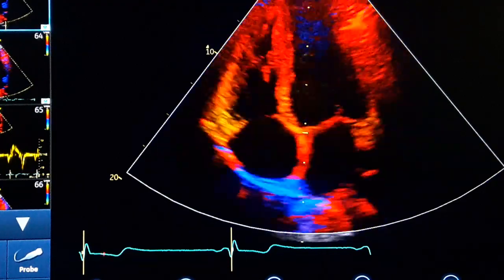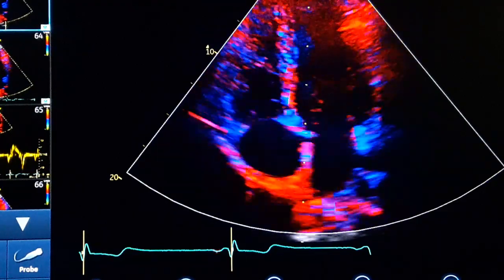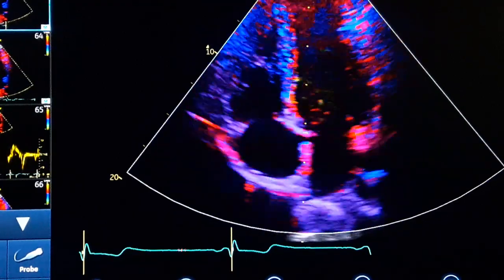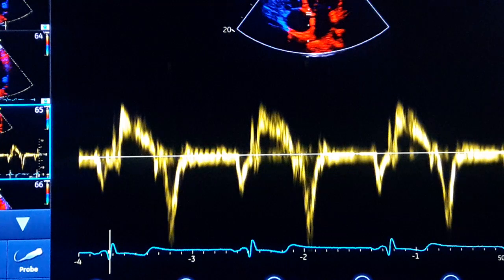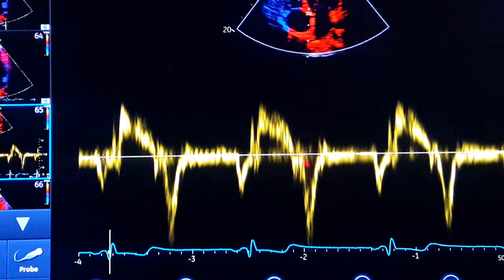After that, we hit the pulsed Doppler and we get a tissue Doppler image like this. So we have many parameters to evaluate.